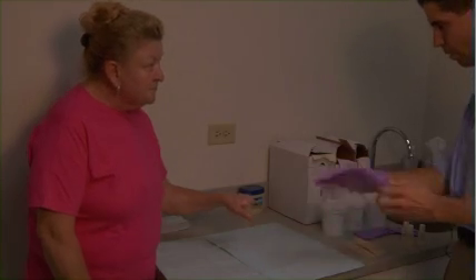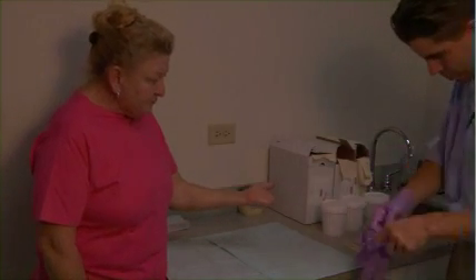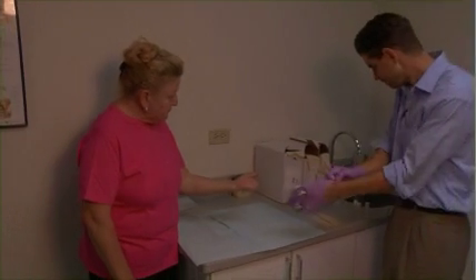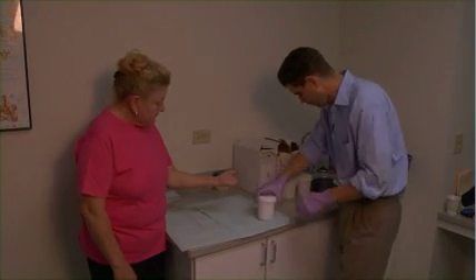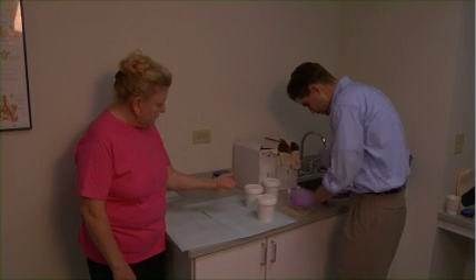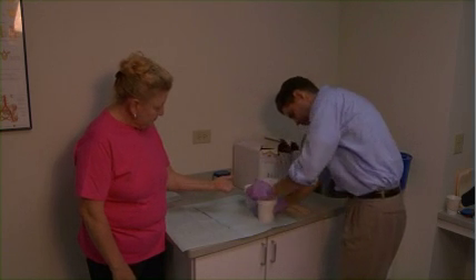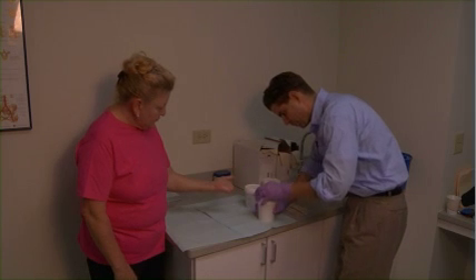We'll start with the palm — with your palm up. What I'm going to do now is open up the first jug of silicone here. I'm going to get this guy on deck.